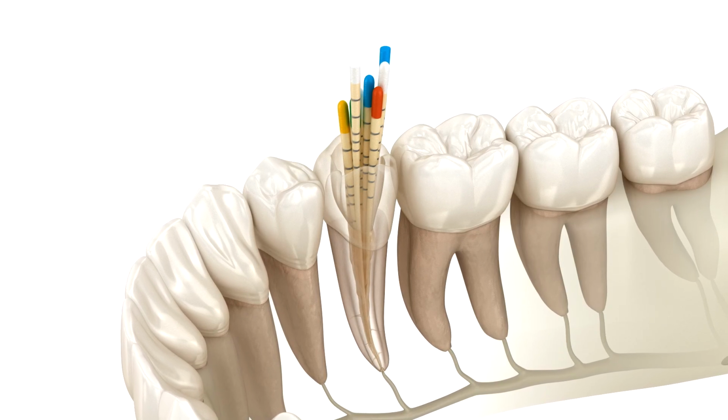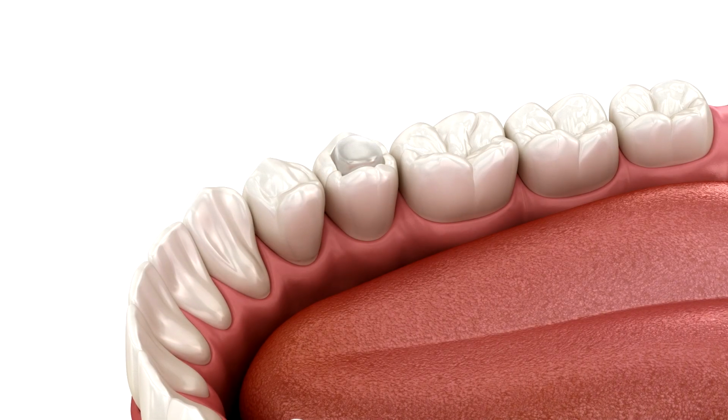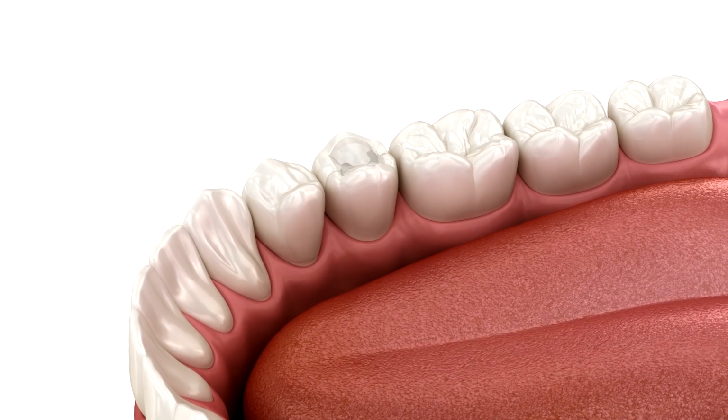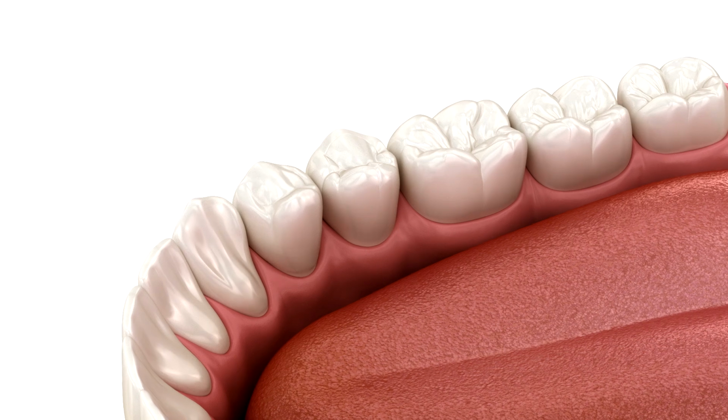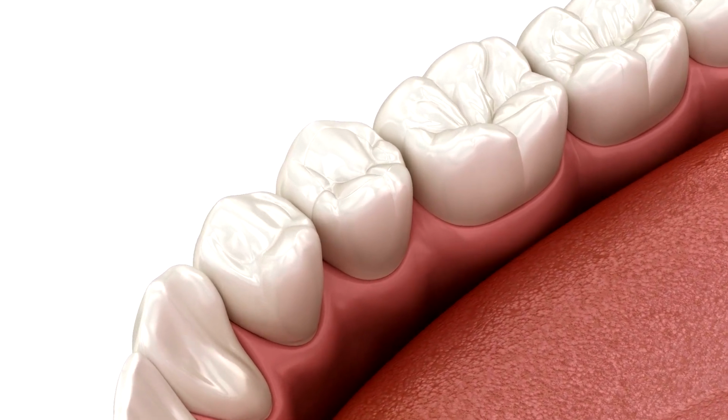Once the cavity is prepped, a composite filling is applied. This specialized resin mimics the properties of your natural enamel. This dentistry technique not only restores the tooth's appearance, but also seals it against future bacteria.